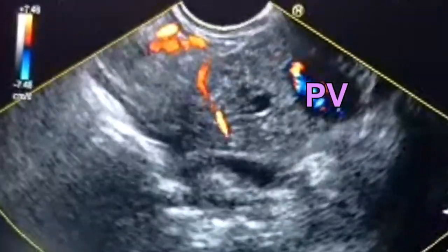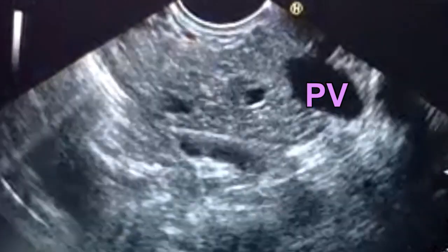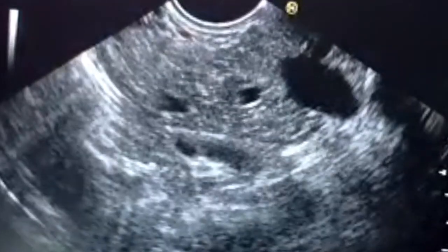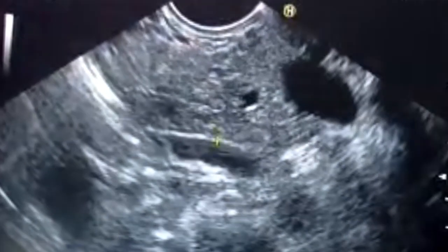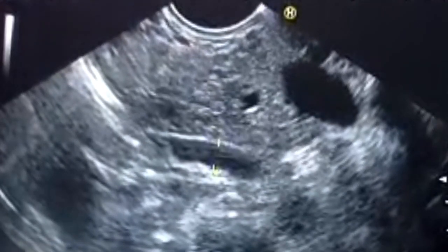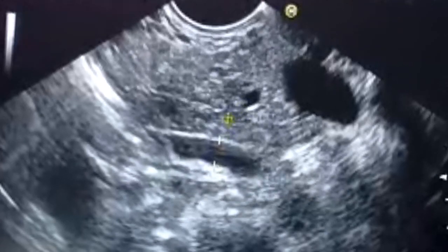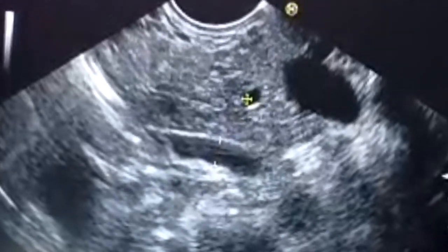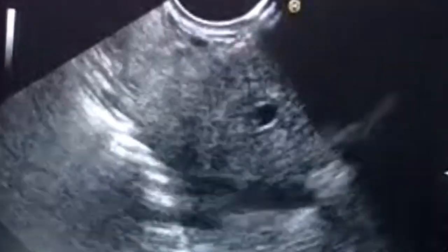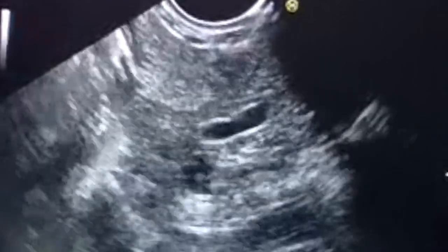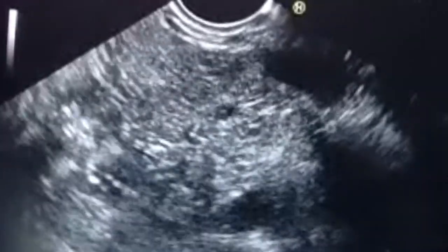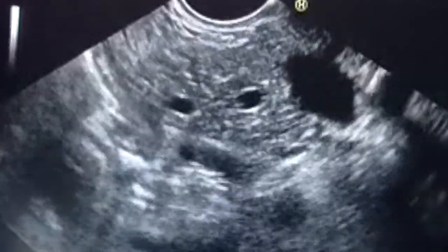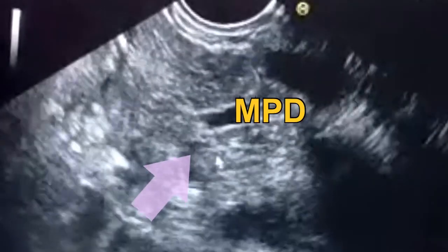This is the common bile duct. It is about 5 mm, and this is the main pancreatic duct. We will scan this common bile duct and the main pancreatic duct. Here there is a cystic lesion.